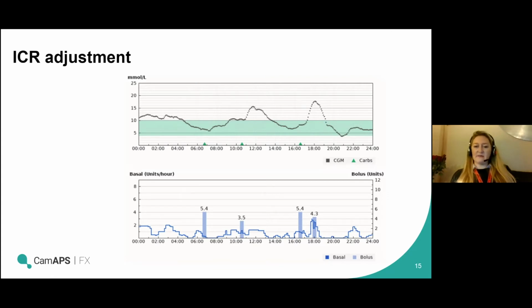And the same then with that next bolus later on in the day. You can see in this situation, the bolus appears to have gone in before this big spike, but after it's gone in, you've got this big spike that again is making you start to think, is there an issue with the carb ratio? Is it the choice of carbs? Is it the carb counting? And having a think and a discussion with the person, or just thinking for yourself, am I getting my carb counting right? Is there anything I can do to change the quality of the carbs if that's an issue? And potentially when you look at this, if the carb counting is accurate, then the carb ratio is the thing that you would want to adjust and bring down by about 10% initially to see if it made a difference for those times of day.